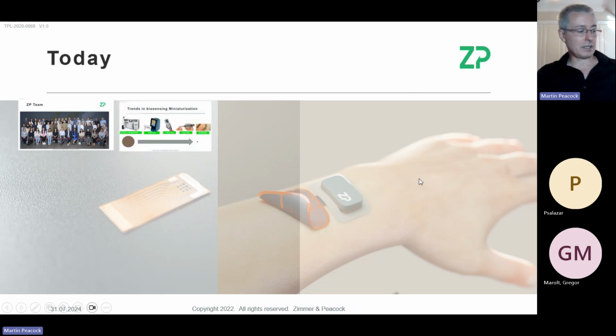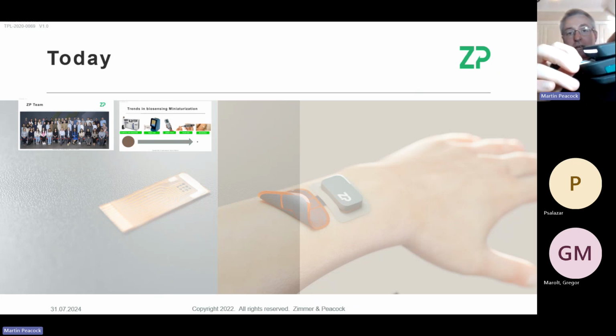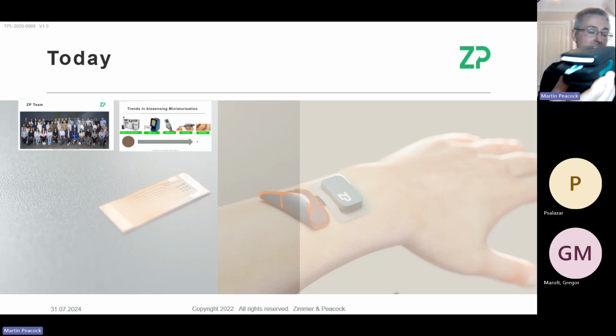I will talk about trends in the market. Once upon a time, I would describe the trend as decentralization from centralized testing to distributed testing, which I would describe as point of care IVD type testing. In fact, I'll bring this in. If you could see my camera, this is a new type of potentiostat that's both a potentiostat for lab work, but it's also an instrument for going to market in the IVD space, in vitro diagnostics. So along this direction of miniaturization, IVDs got to this kind of size.